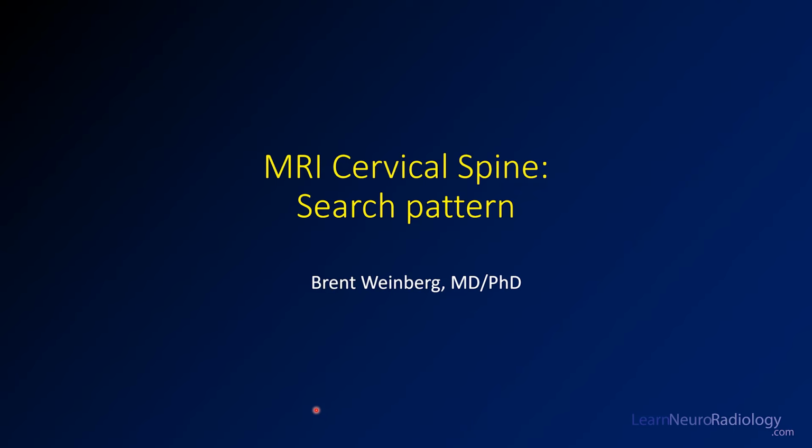At this point, I'd just like to point out, if you haven't taken the time to watch some of the videos on basic spine imaging, you might go back and take a look at those, or if you're completely unfamiliar with spine imaging, it may be helpful before you take a look at this video.